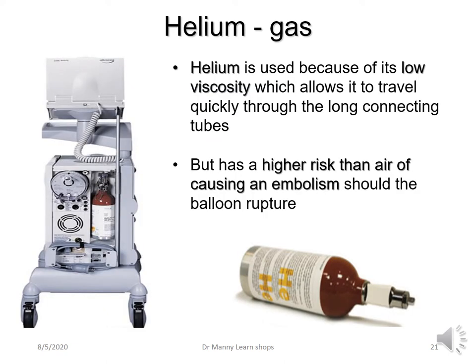Then you've got the helium gas. Helium rather than air is used because helium has low viscosity. It's an inert gas, which allows it to travel very quickly through a long connecting tube and balloon. But if the balloon ruptures, there is a higher risk of embolism occurring with helium than there is with air. But it's reasonably uncommon.